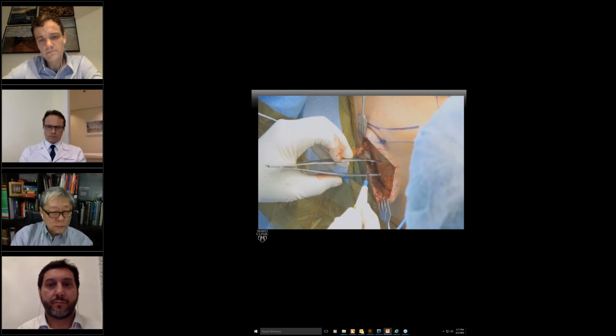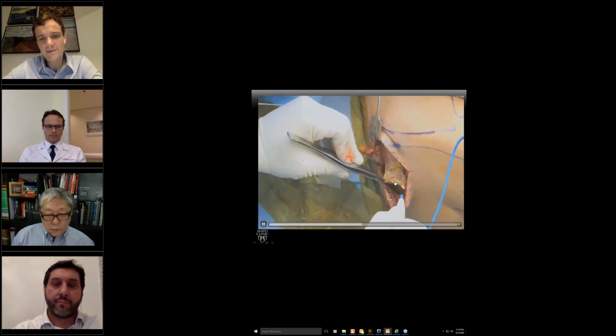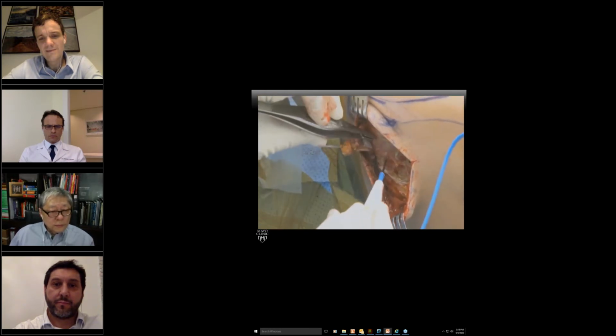So what that means is if you open it and you go below it, you are between the deltoid and the infraspinatus. So it comes on the infra and on the deltoid. If you take it out and you go below, you are between the deltoid and infraspinatus because the fascia comes on top, superficial. So I always make a big hole in it. I pull on and I cut this fascia. And if there's muscle that's not working, like in this patient, you can see there's fat, there's nothing, and I make a big hole. What's the problem? There's no issue. You can make it as big as you want.